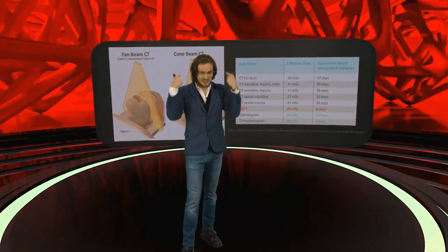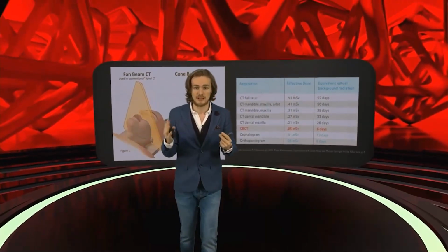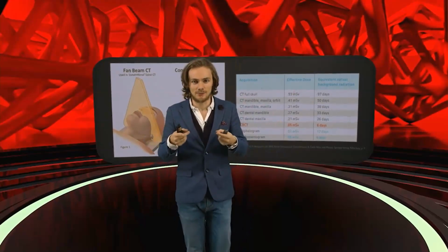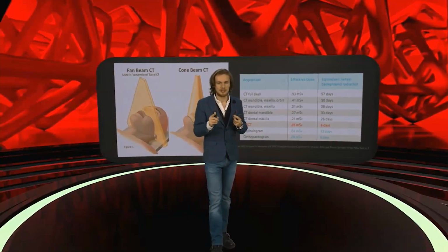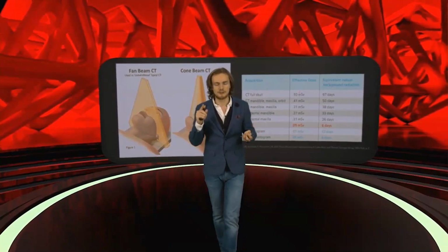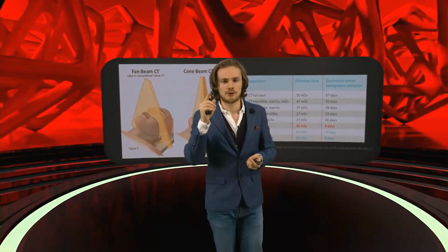We do not do a big CBCT for our patient and a couple of them just to compare some structures, just to make a nice presentation for Facebook. Let's not treat our patient as an experiment. This is my message to you. So if you really need it, don't think about the harmful effect of radiology, but only if you really need it. So keep your questionnaire and your examination in mind just to decide if you really need imaging.